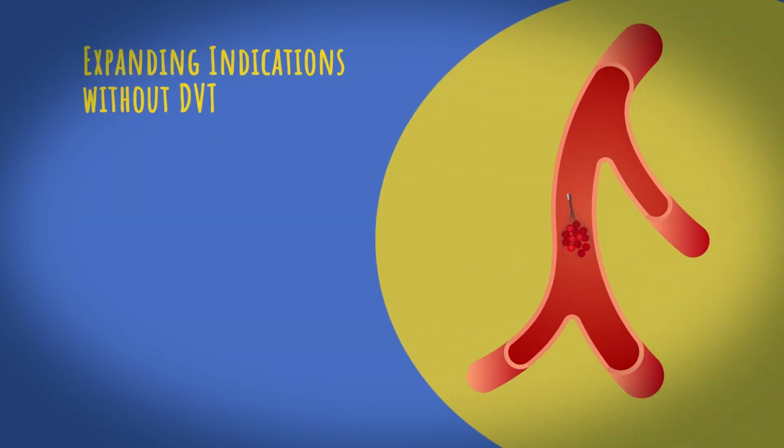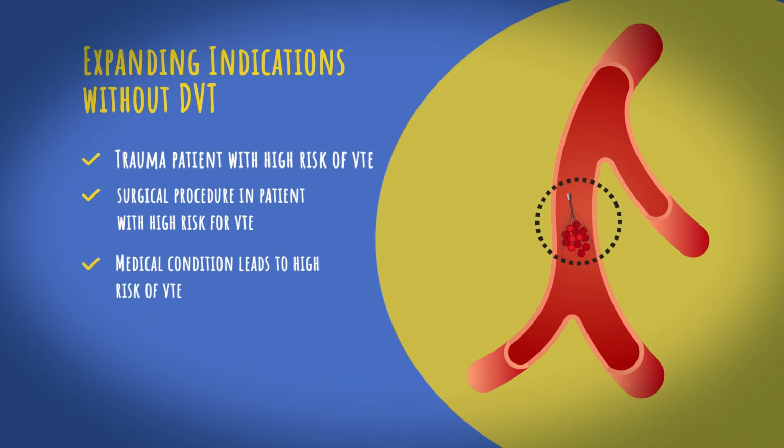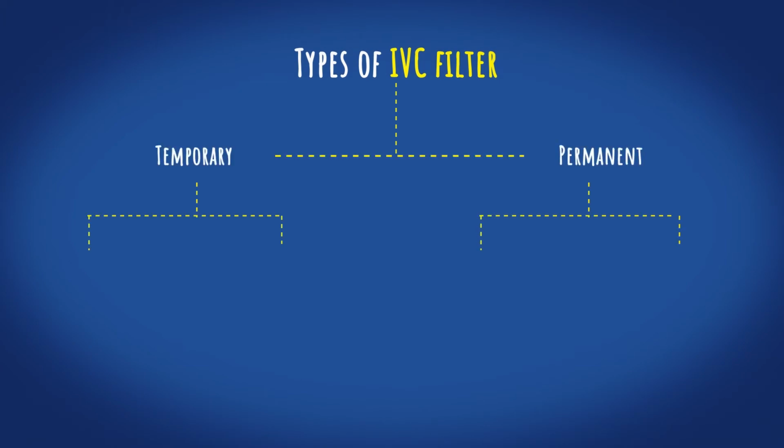Expanding indications without DVT include trauma patient with high risk of VTE, surgical procedure in patient with high VTE risk and medical conditions increasing the risk of VTE. IVC filter can be classified as temporary and permanent.